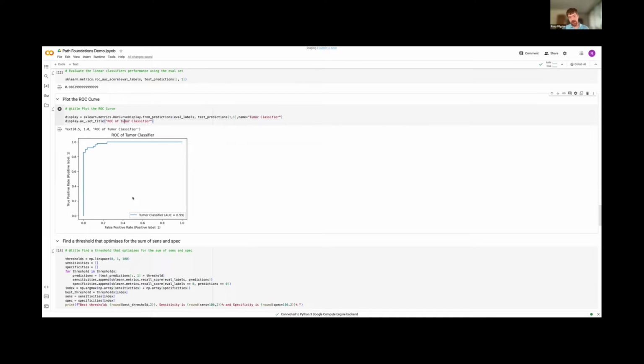And we've actually got an AUC, for those who understand AUC, it's a receiver operator curve, area under that curve, of 0.99 in this example. So that's a very high classification performance, and it means we're more or less getting the vast majority of cases right on those labels.